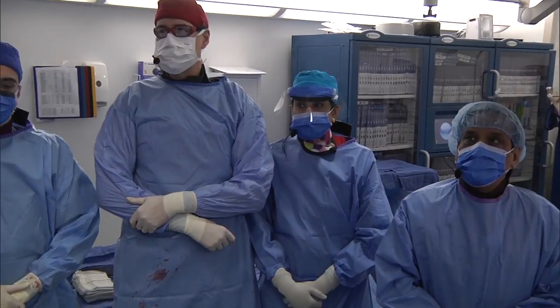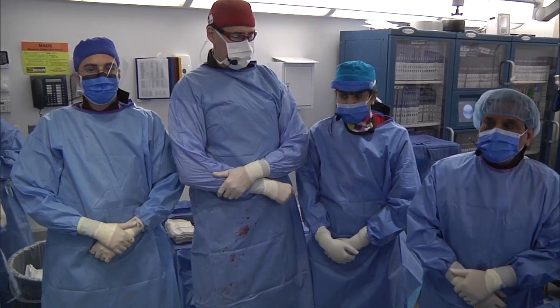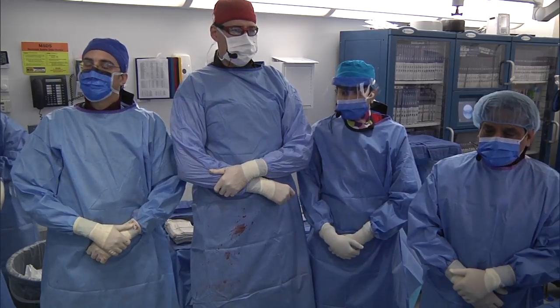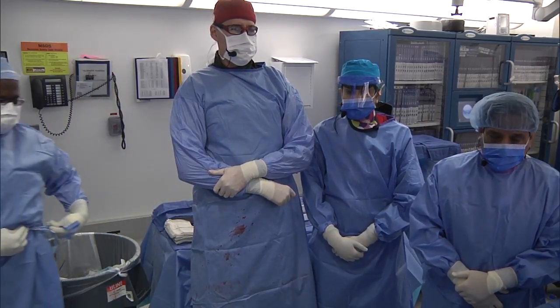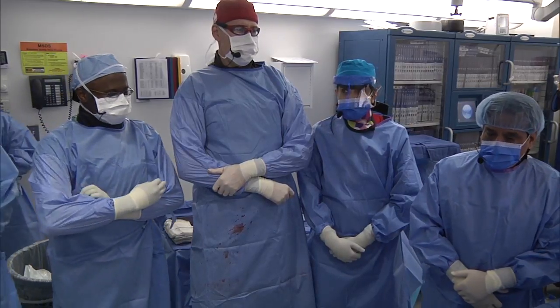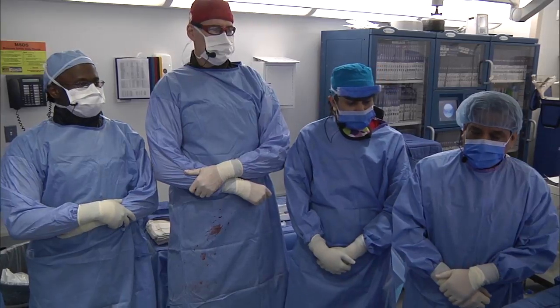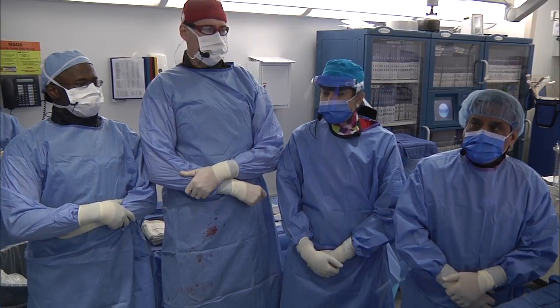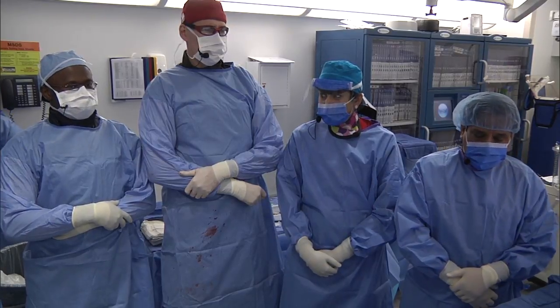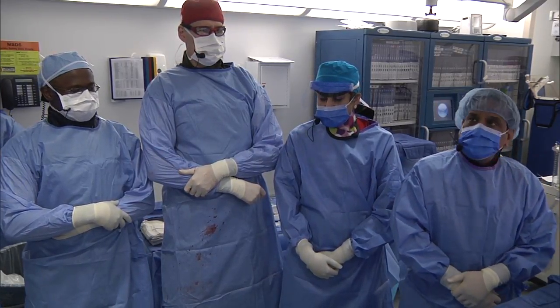So with that note, these cases basically go through the techniques and try to show and duplicate the excellent results which we are having at Mount Sinai. We are done for coronaries and of course now for some endovascular. So the purpose will be to go through step by step what is being done in these TAVR cases. Of course, it's a multidisciplinary team approach, and everybody will be involved, and you'll hear discussion by everyone. So with that note, I think we start.